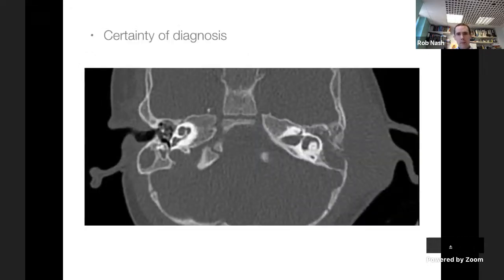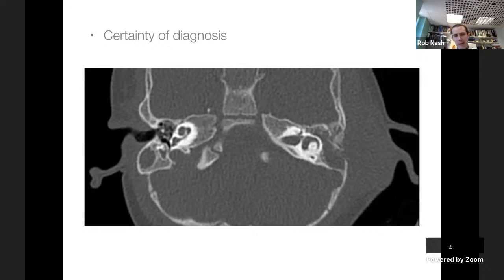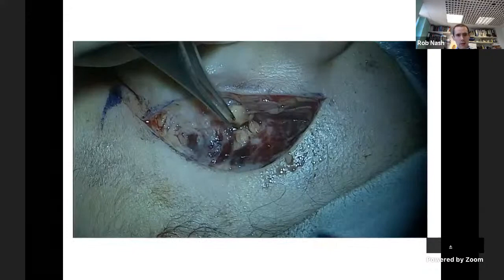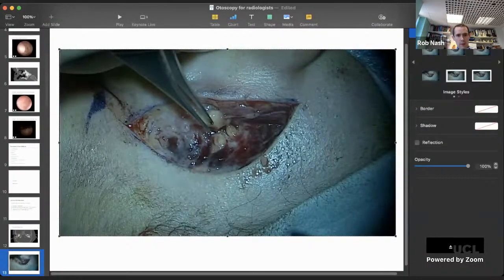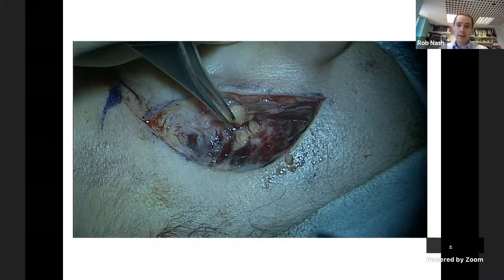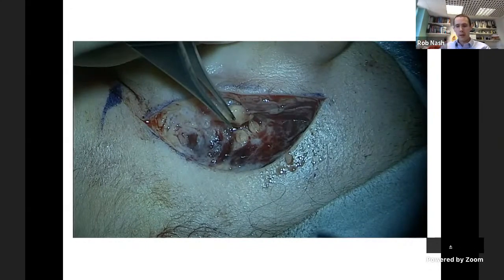This is an example of imaging for certainty of diagnosis. This patient has a red eardrum with swelling in an atypical pattern for glue ear, and soft tissue swelling lateral to the mastoid. CT and MRI are performed to evaluate this. The finding in this case is not glue ear - it is Langerhans cell histiocytosis, which is much more readily diagnosed from imaging than from otoscopic findings alone.